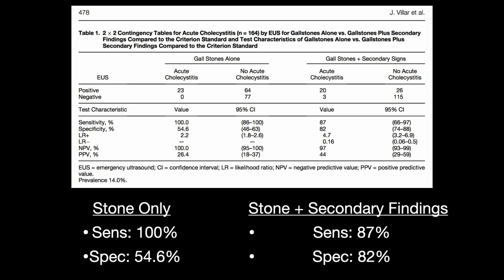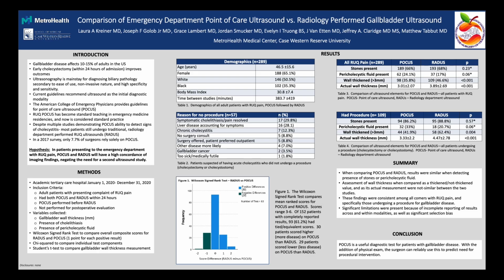And this paper would justify that. And the final thing that I want to show is a study that we started working on a number of years ago. This is an abstract or a poster that we presented, basically trying to answer the question, I hate doing these studies and then have the surgeons come back and say, oh, well, can you just get the formal ultrasound because I don't trust your scan?